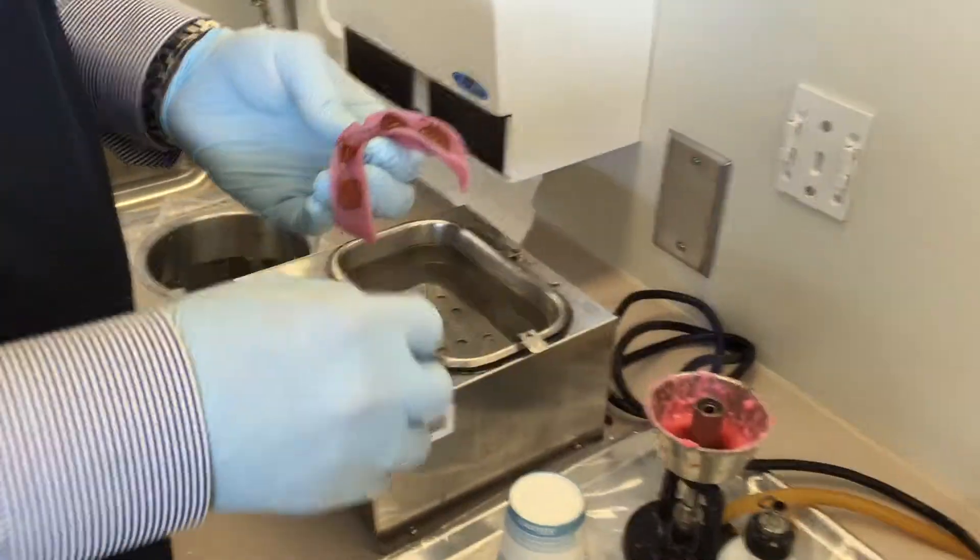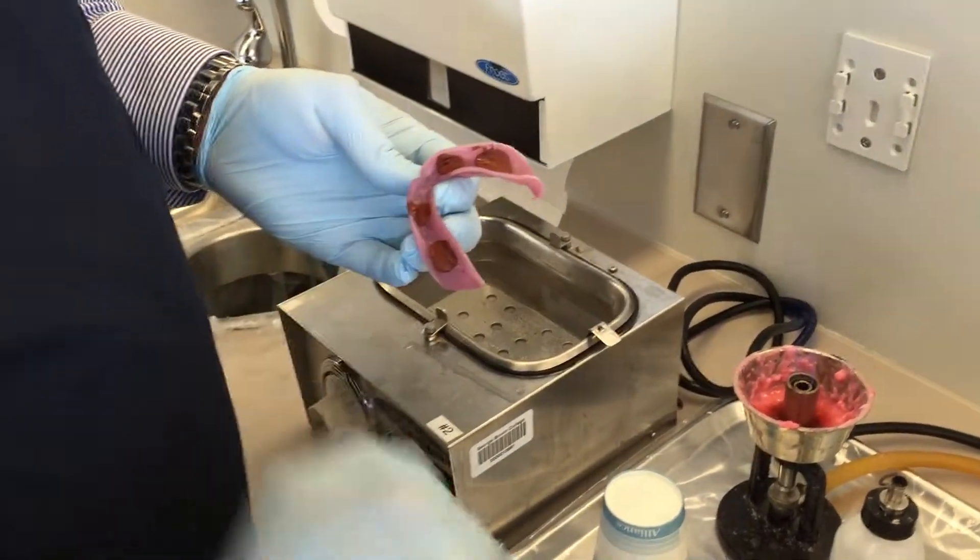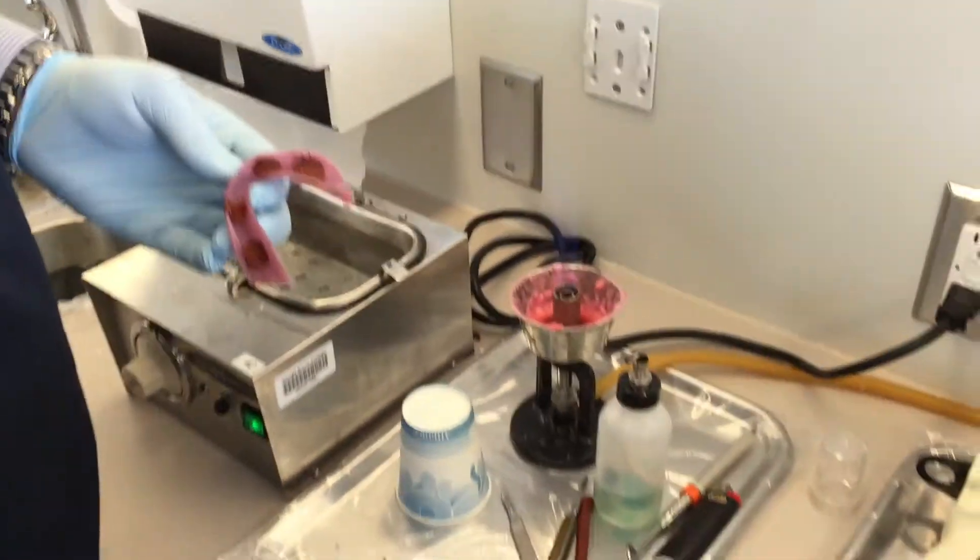Okay, so the next step of the border molding procedure for the lower, I'm going to use the heavy body PVS material.